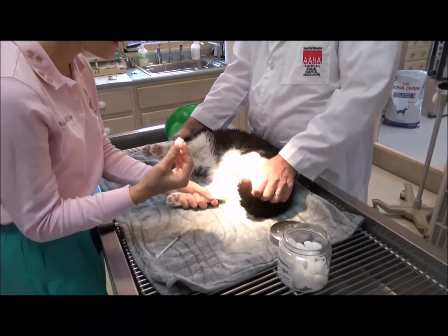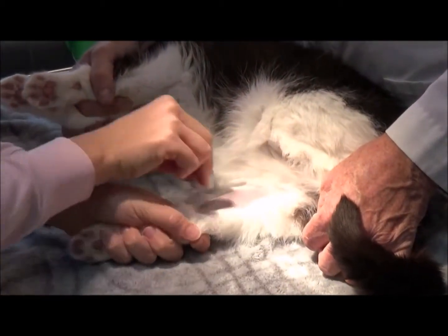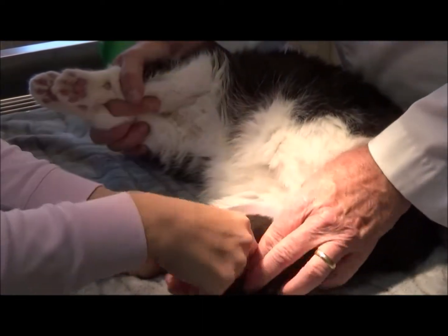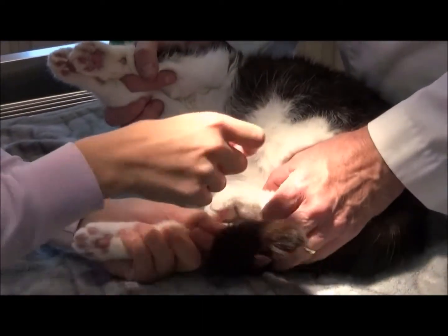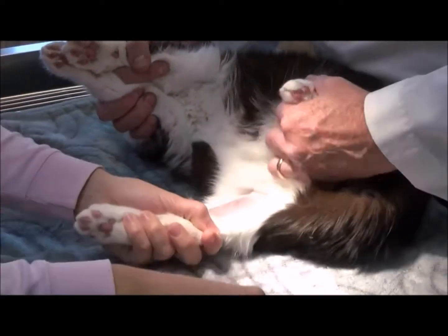I pre-clipped the area, so now I'm going to cleanse it with alcohol. And then I'm going to have somebody else hold off the vein for me. That go in your hand there. Okay. Yeah, over there.